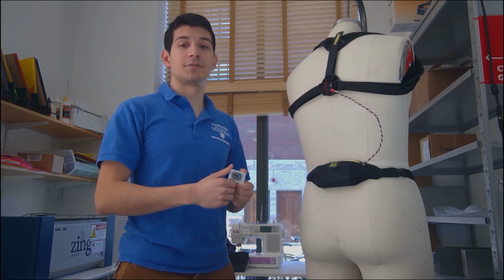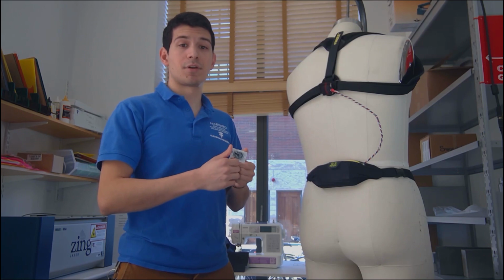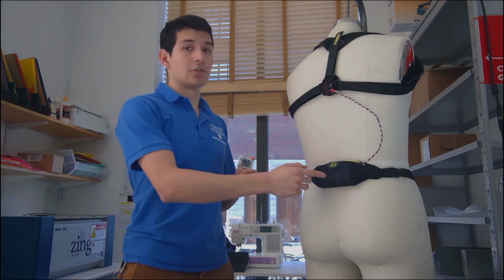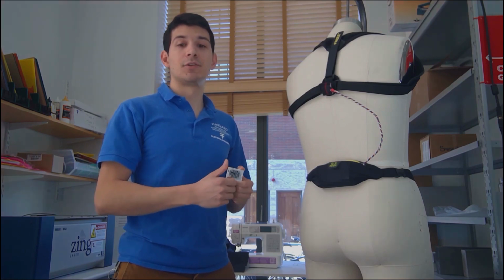For my thesis, the goal is to help athletes reduce the risk of these injuries by learning to maintain better back posture during lifts. My project uses inertial measurement sensors comprised of an accelerometer and gyroscope to measure the curve of the spine, as well as using targeted haptic and auditory feedback to alert the athlete of when back posture deviates from normal.